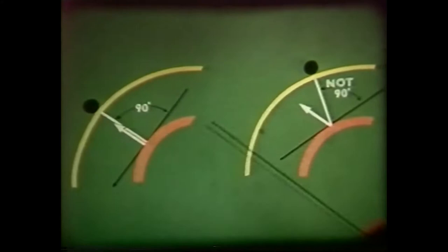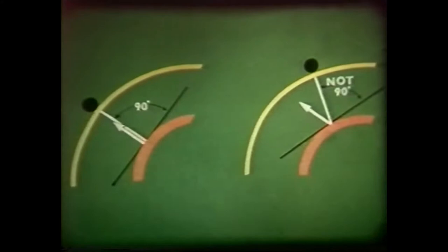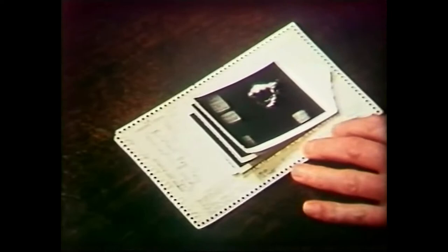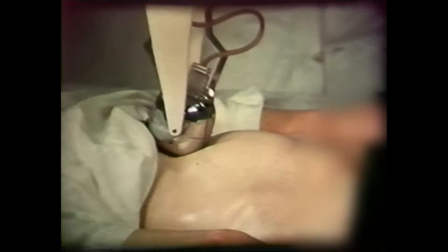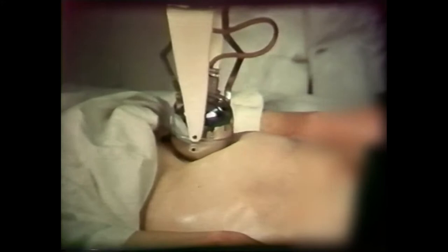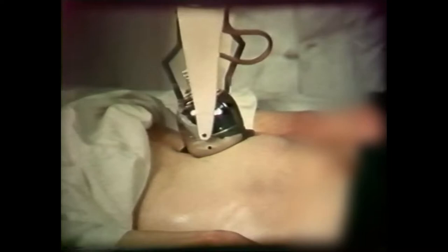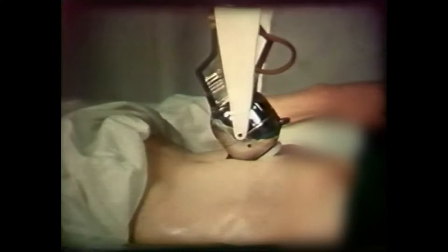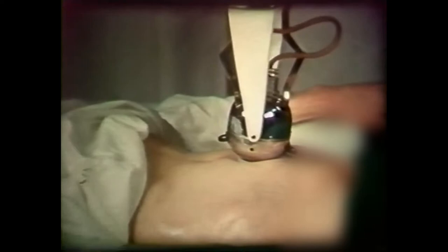Our ultrasonograms are filed in this manner, and here we see the records which we obtained from the patient we are about to demonstrate. The tumor is more than halfway up to the umbilicus from the pelvis. There is associated ascites, and by manual examination the uterus would appear to be displaced to the right and behind the tumor, which is not wholly fixed. The diagnosis is probably that of ovarian cyst, but the patient is virgo intacta and it is not easy to be certain.